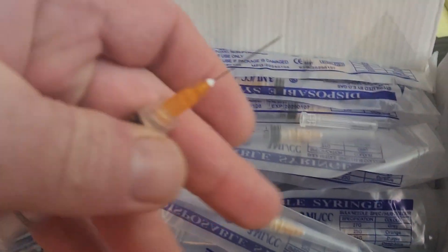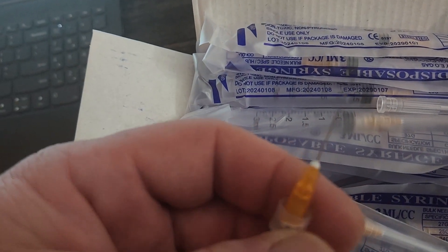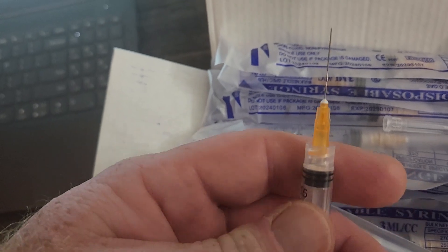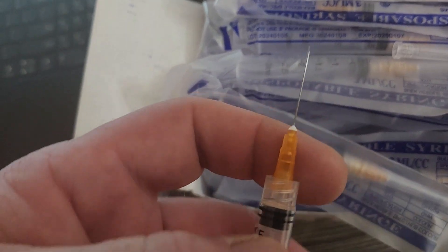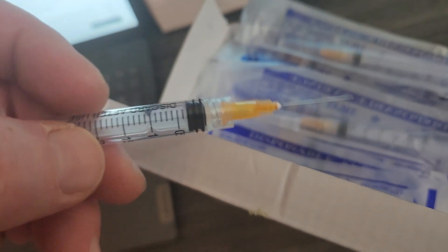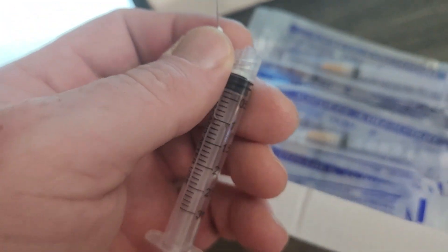Here's the needle. It's a short 1 inch — very small, you can see that. Definitely a 1 inch. It's a luer lock, so it unscrews and you can put other luer lock fittings on there. The syringes do the job.